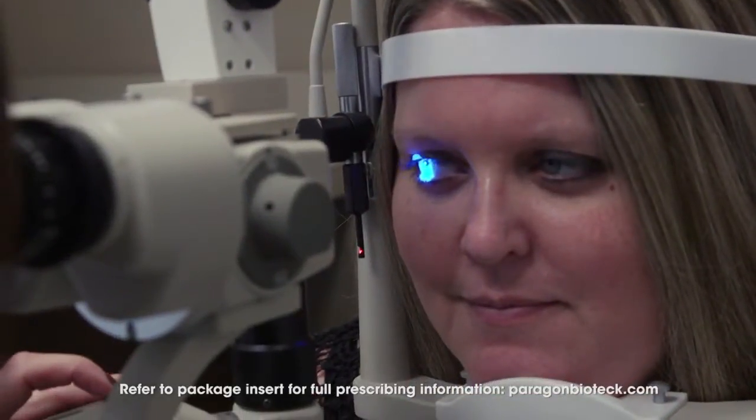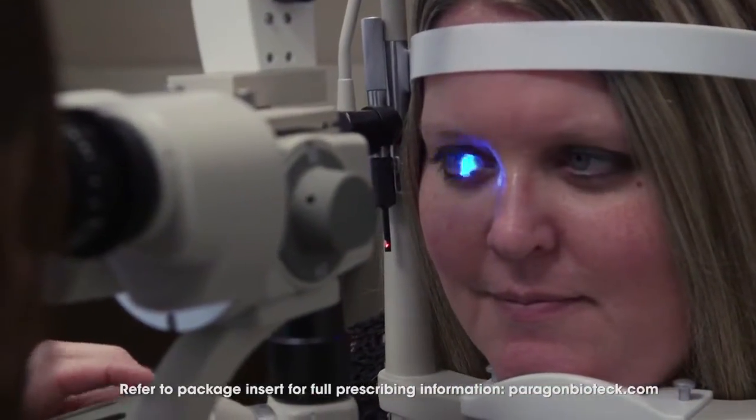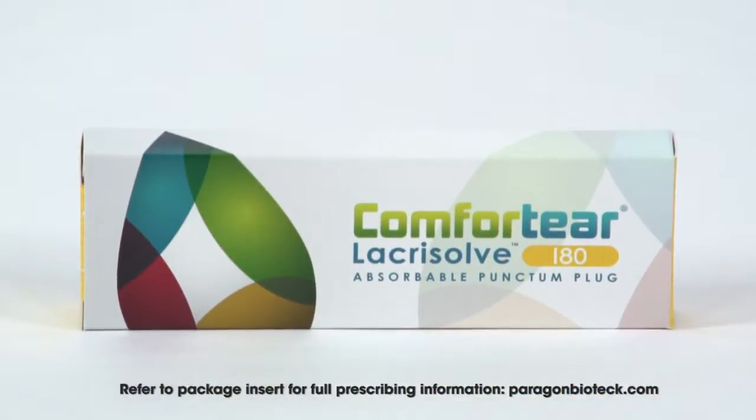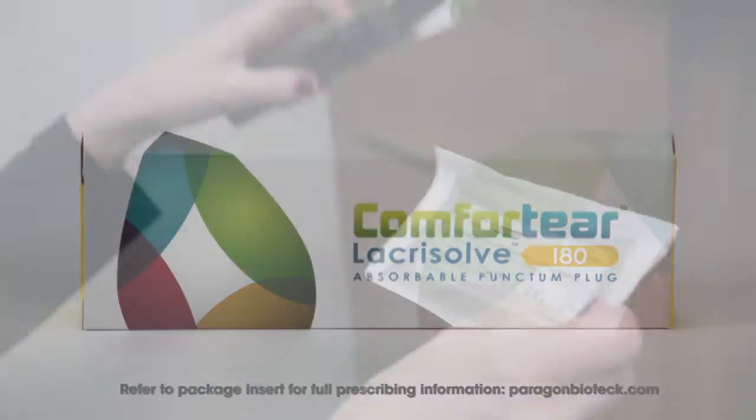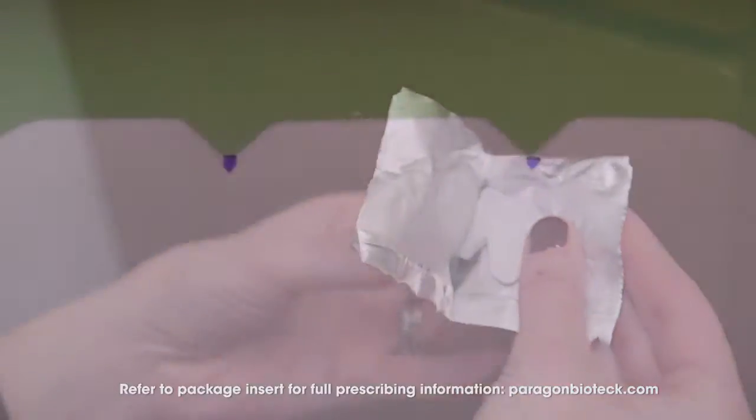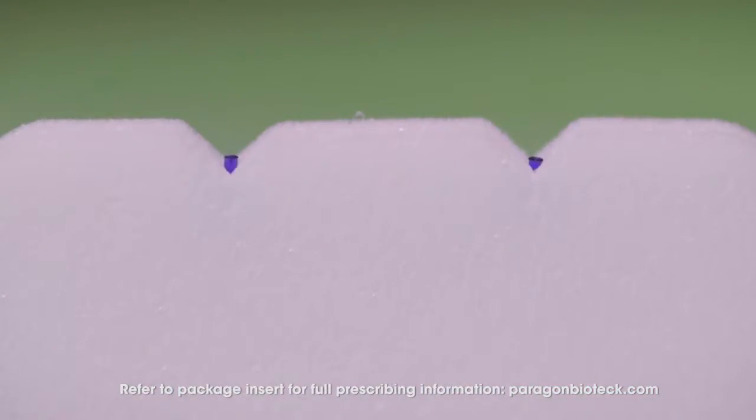In order to select the correct plug size, visually inspect the patient's punctum. The Comfortier Lacrizov 180-Absorbable Punctum Plugs are made of polydioxanone. They come in a sterile pouch with two plugs per pouch, and each box contains a single pair of plugs. It doesn't irritate the tissue, and has good strength and pliability until it dissolves.